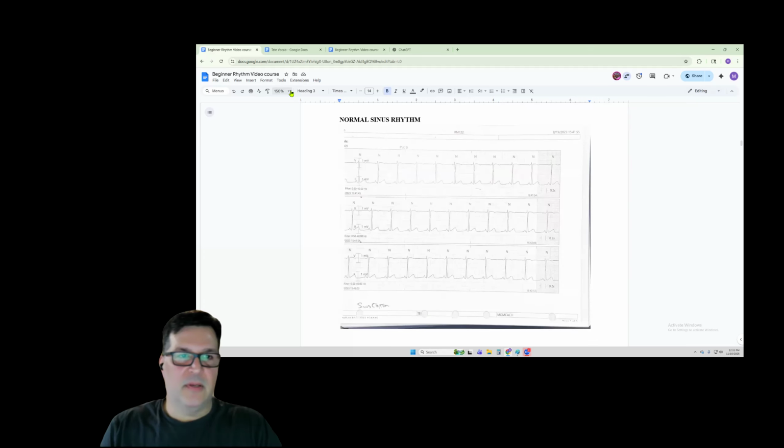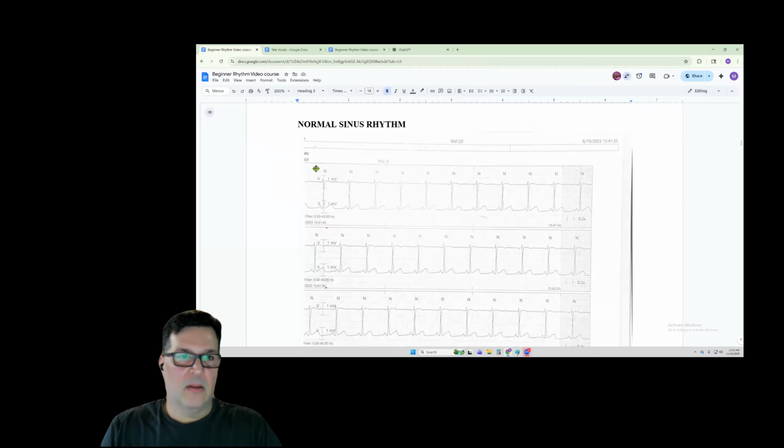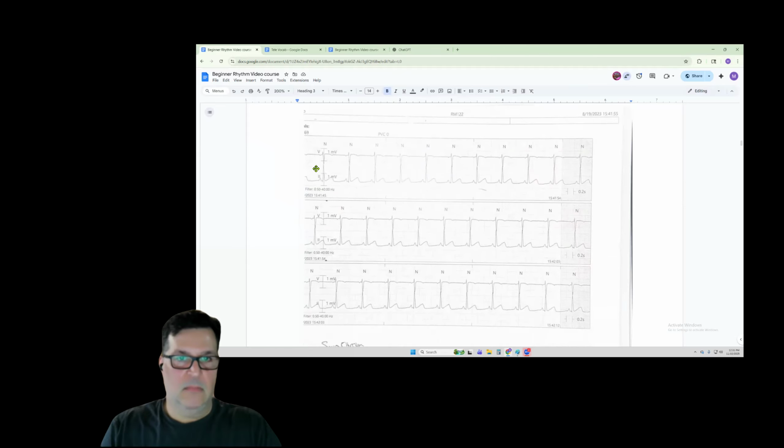So when you have strips up, can you see well? Actually, better, that's not bad. I can. This one here? Yeah. You're breaking up a little bit, sorry. I see the whole strip, but I can see the portion of the strip well zoomed in. Okay.